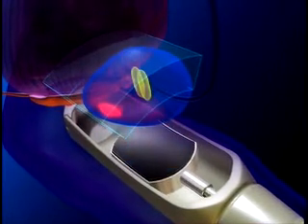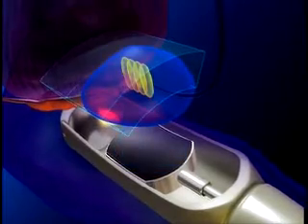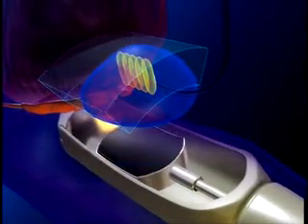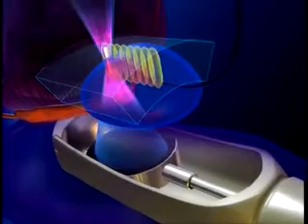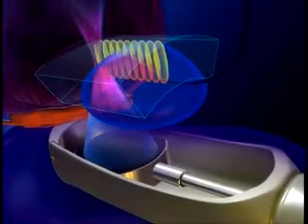The imaging capabilities of the technology allow for identification of vital structures such as the prostate capsule, seminal vesicles, rectal wall, and physiological location of the neurovascular bundles.